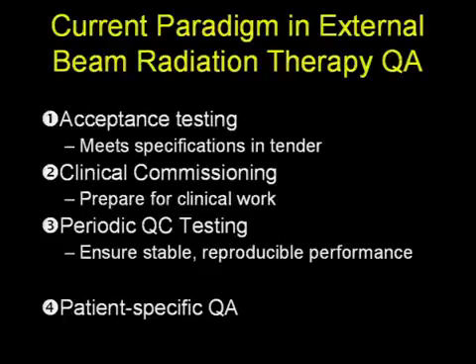So having presented an overview of these technologies, I will go through the classic paradigm for quality assurance as can be applied to these new devices. Just following the guidelines from the AAPM TG40, one can have a generic quality assurance paradigm that can be applied to any technology. And this paradigm starts with acceptance testing, that is, ensuring that the device that you just purchased performs according to the specifications in the tender.